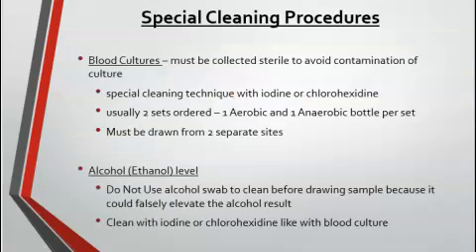When we're completing phlebotomy for certain tests, we have to complete certain special cleaning procedures. We already discussed special cleaning procedures for our blood culture bottles. We want to avoid contamination or skin contamination when we're collecting our blood culture bottles.